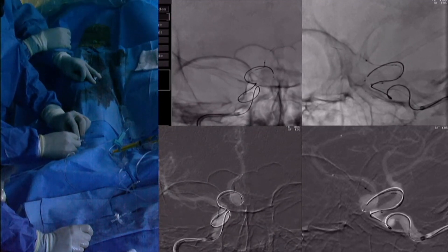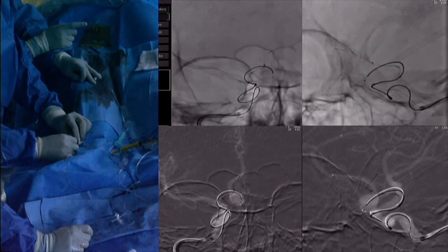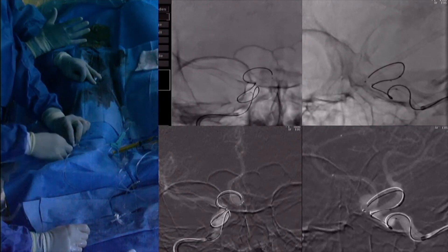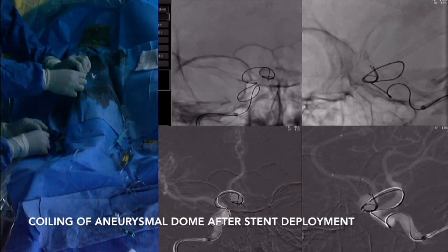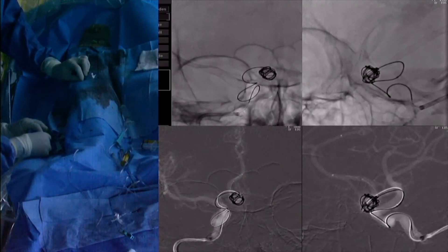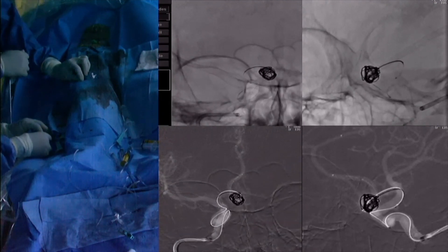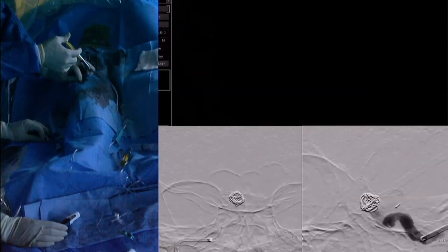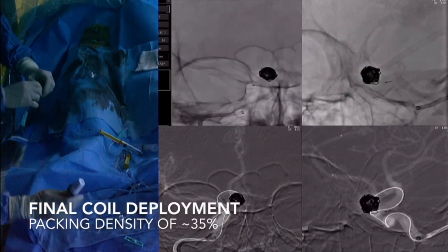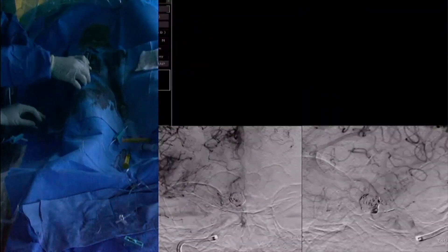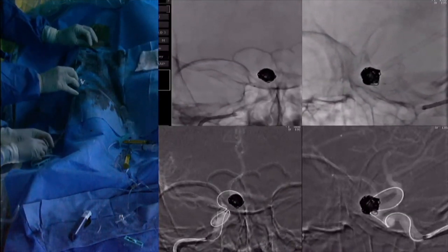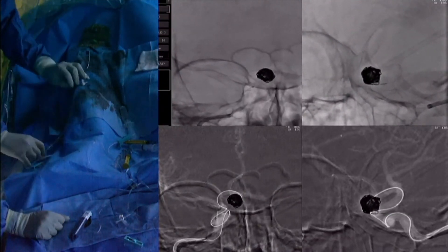We continue to unsheathe the stent, bringing the stent now across the aneurysm into the A1 segment. Once the stent is effectively placed across the A2 segment, the anterior communicating segment, and the A1 segment of the anterior cerebral artery, we can effectively coil the aneurysm without herniation of the coil into the parent vessel. We continue to coil the aneurysm until it is completely coiled and we have good coil occlusion. This effectively concludes stent-assisted coiling of an anterior communicating artery aneurysm.